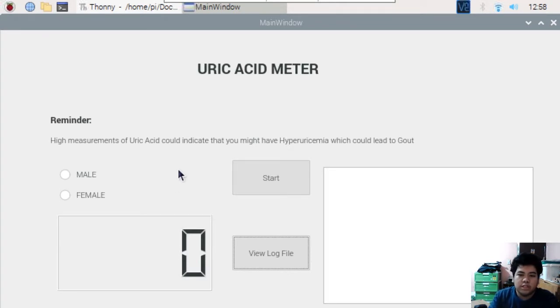First, this is the user interface of the device. The program has a selection for whether you are a biological male or female, and two buttons: the start button starts the measurement of the device, while the view log button opens another window that lets you view previous measurements.